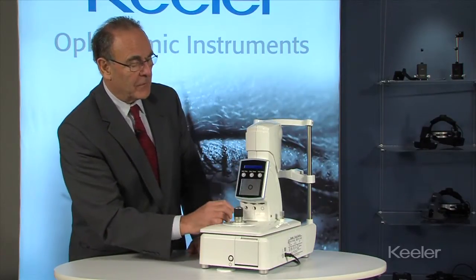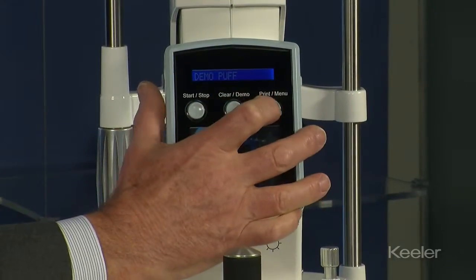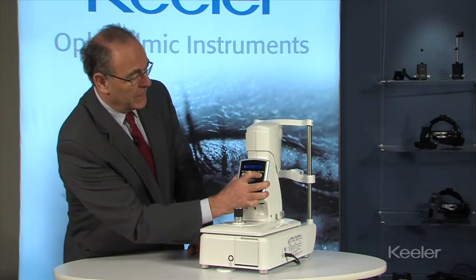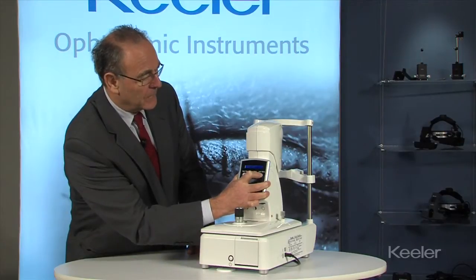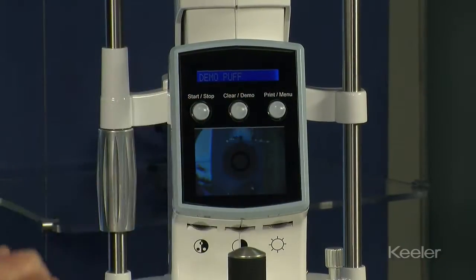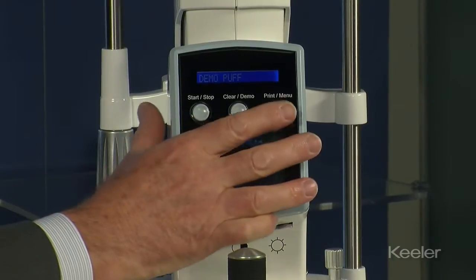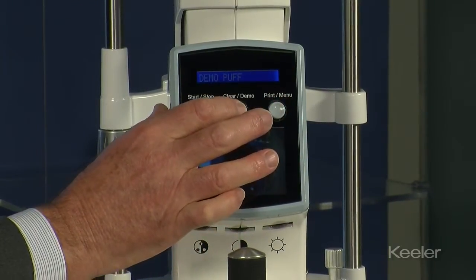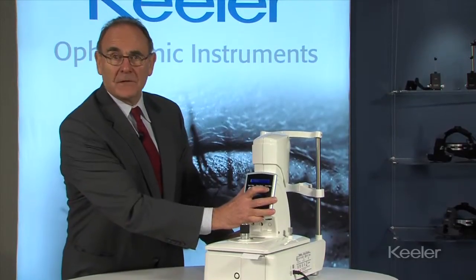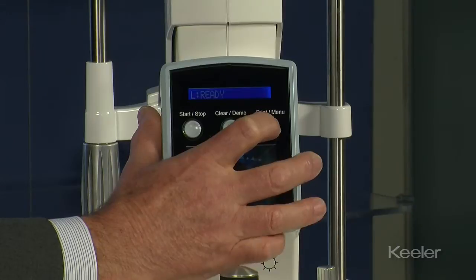On the far right you have the printout button, and holding it in for about three seconds will bring up the menu where you can adjust the buzzer, adjust the IOP decimal point position, and turn the printer on or off. The final function on the menu is the self-test, which is a 45-second calibration check.